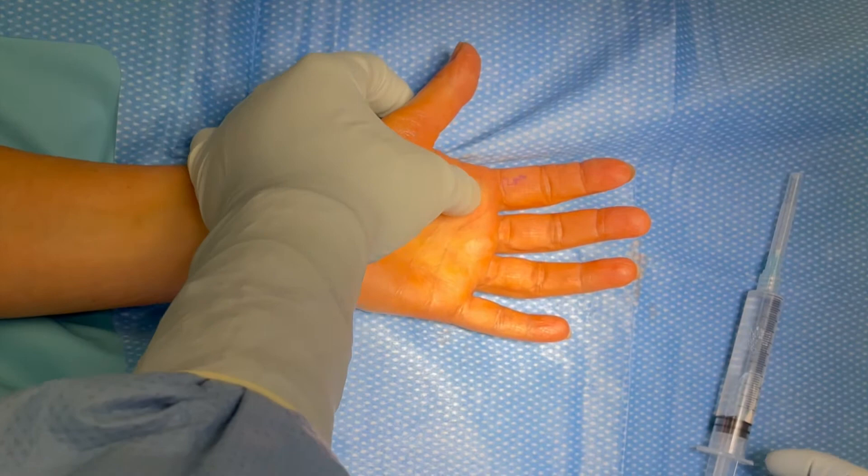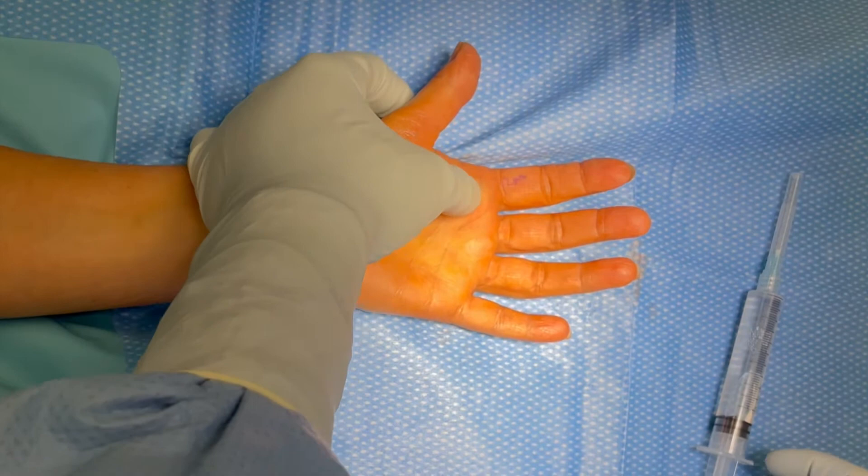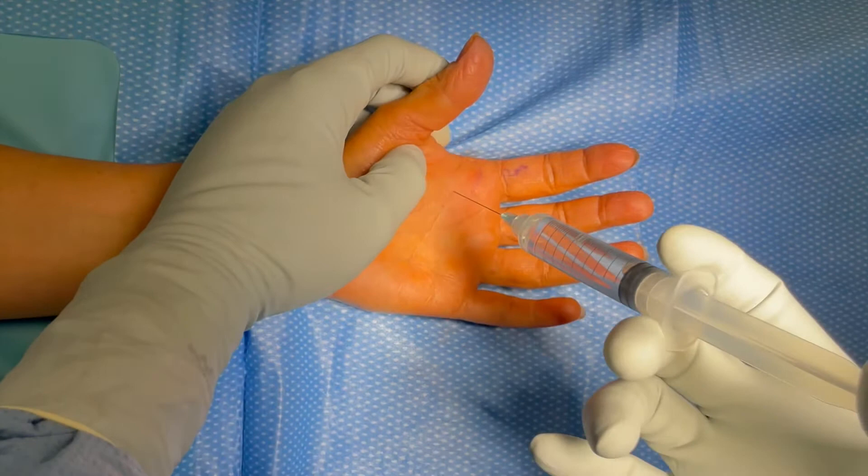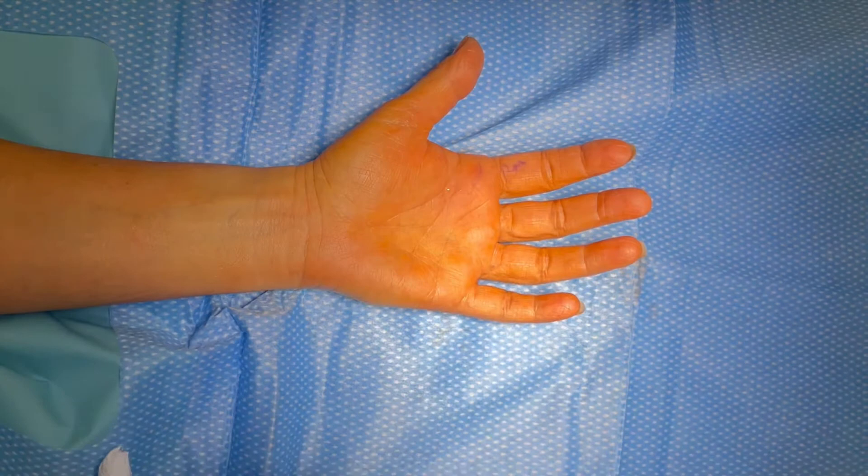This orange glow is caused by the deposition of something called hemosiderin, which is basically iron that's been left over after some sort of bleeding episode from the tumor. That hemosiderin is responsible for its distinct clinical appearance and for its appearance on MRI — both on T1 and T2 imaging — the tumor has a very distinct low signal intensity on both sequence series.